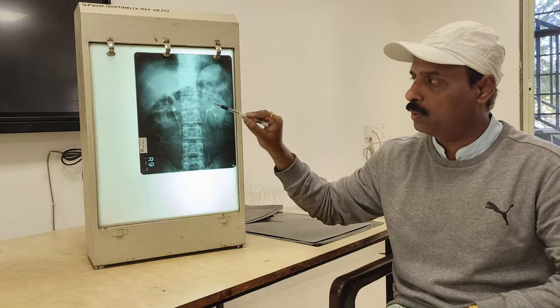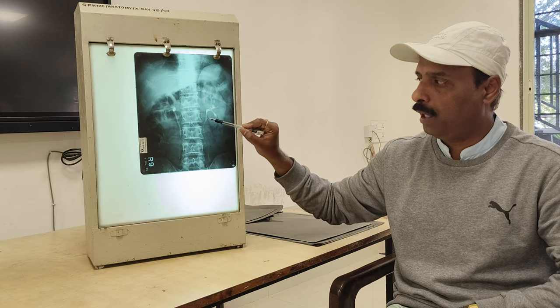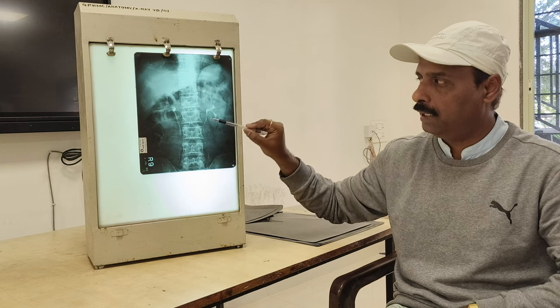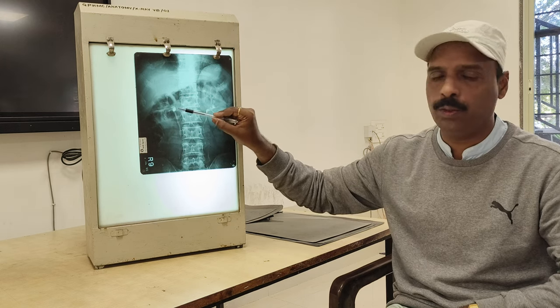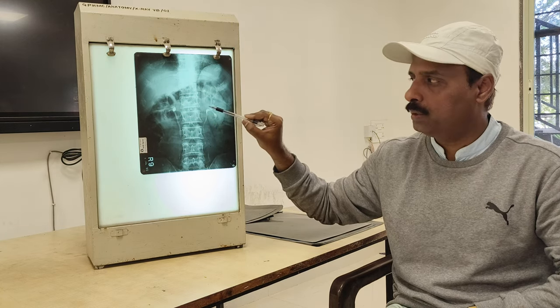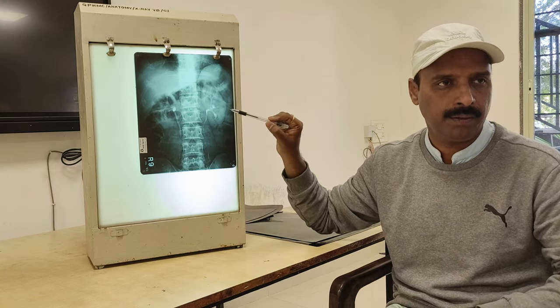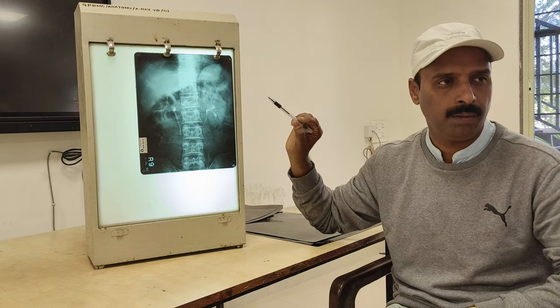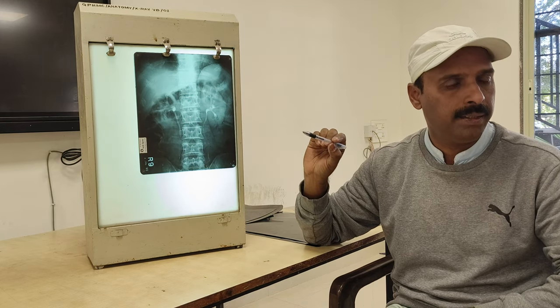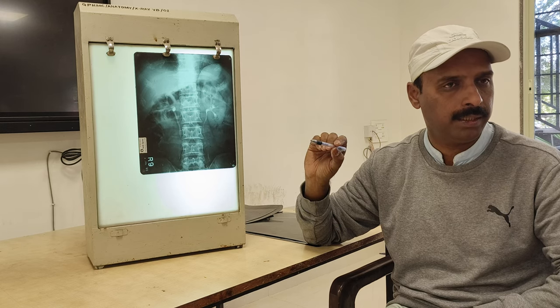Both the kidney shadows we can get here. Here you can see the right and left kidney, and here you have the right ureter and left ureter, which you can follow. Here you can see the shadows of kidney stones, on both sides at the kidney region. So one thing you have to remember is that this helps identify the location and size of the kidney stones.